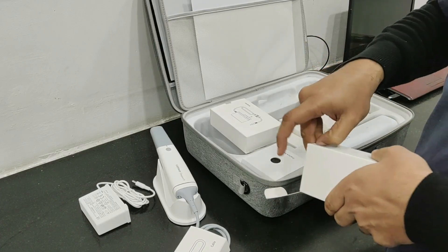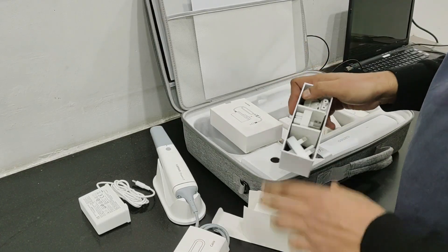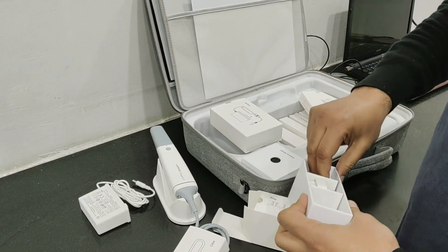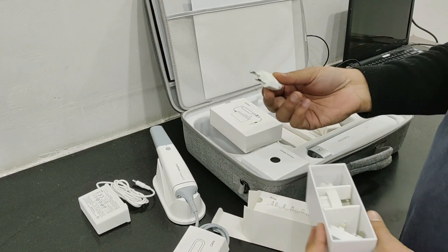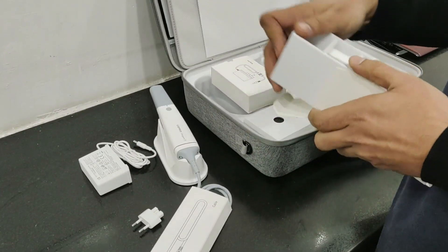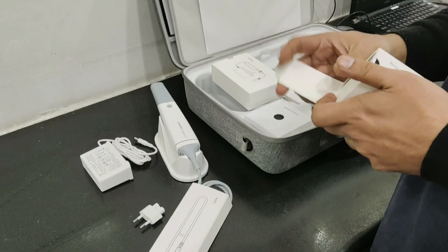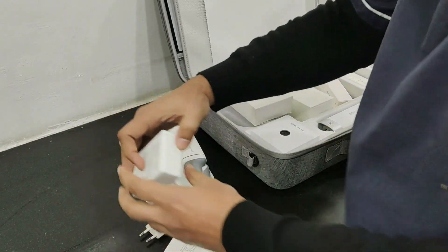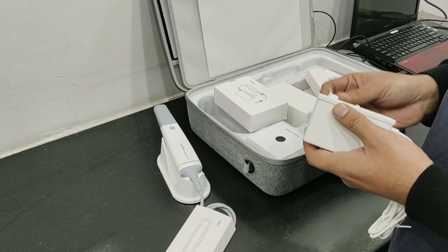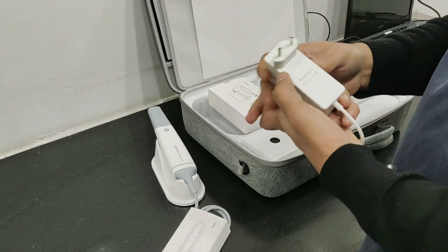This is the power adapter plug. They have given different plugs for different countries. We will take out the one that suits our plug type for India — this is the one — and keep the rest away. We can attach it like this.